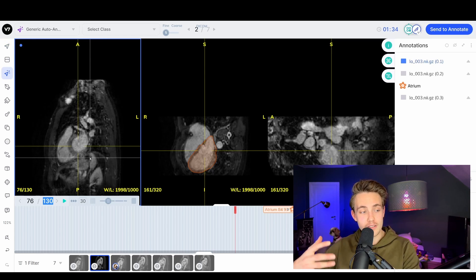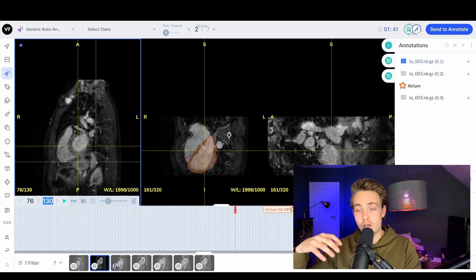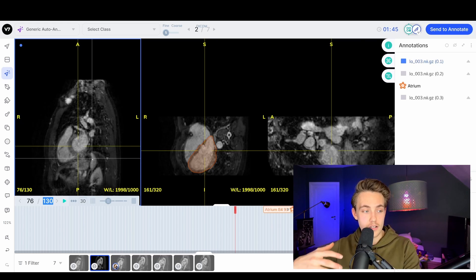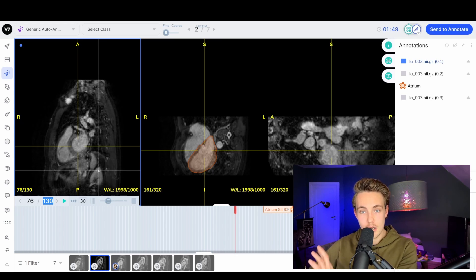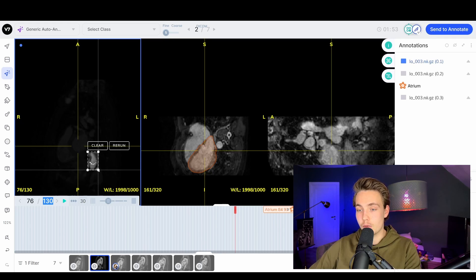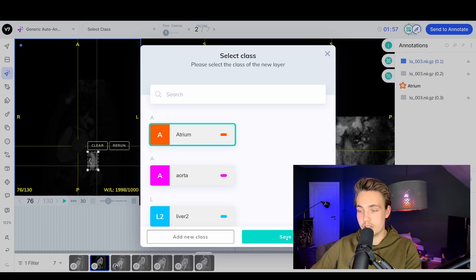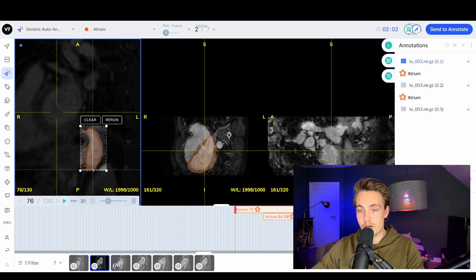If we want to annotate this specific part - it could be any kind of object, like lungs or tumors - you can go in and do that on your dataset. I'm just going to create a bounding box with the auto annotation tool around the part I want to annotate. Then it will find a prediction. I'm just going to choose the class - the atrium. Here we can actually see we get this really nice labeling of our atrium.